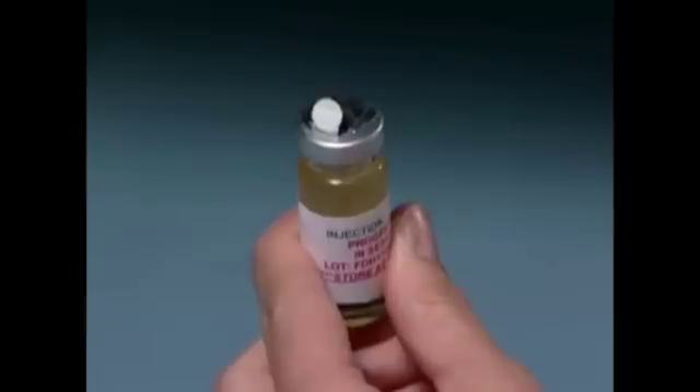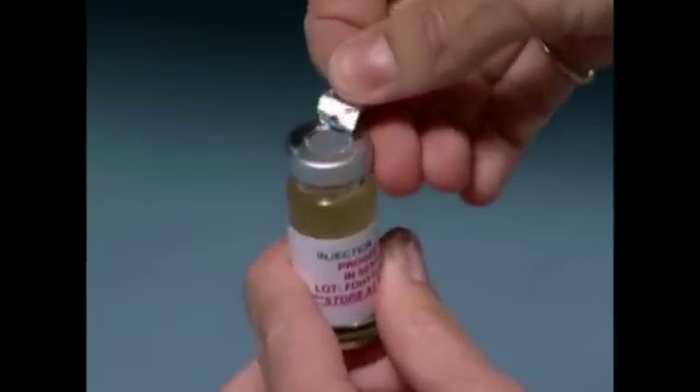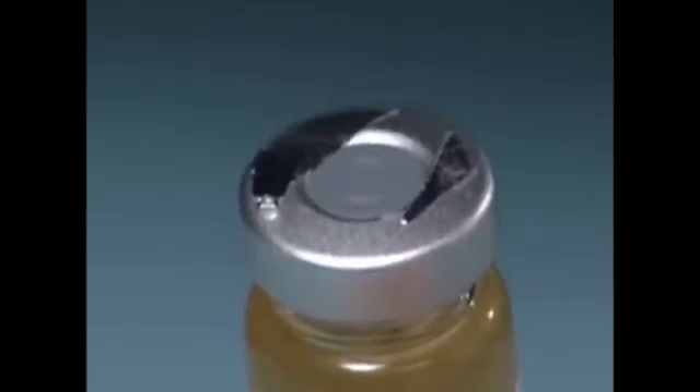Using your thumb, pull the protective plastic cap off of the vial. Wipe the top of the vial with an alcohol swab for each injection of progesterone.